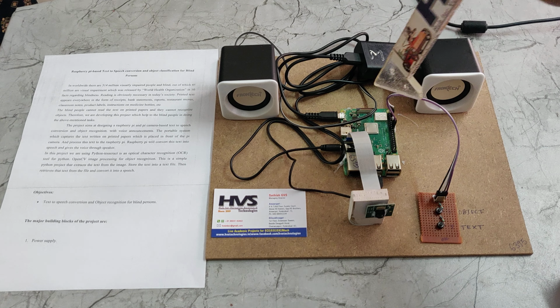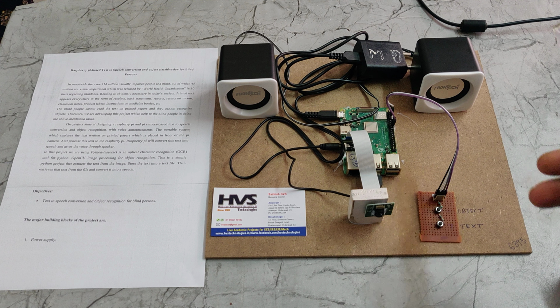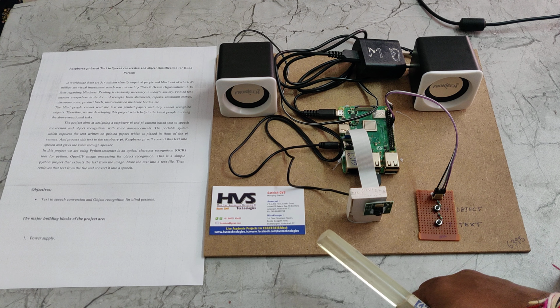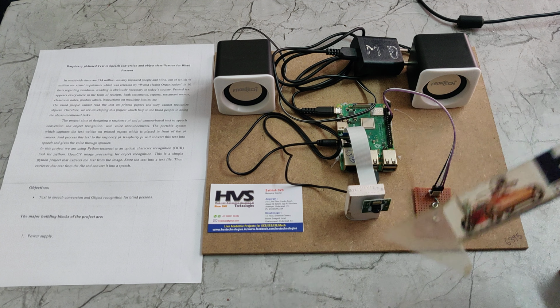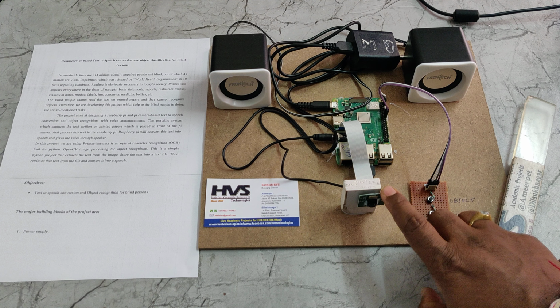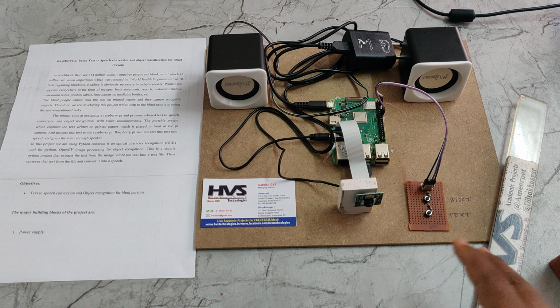Initially we need to load the operating system, the Raspbian OS, into the 32GB class 10 memory card. After loading the OS, we code the project requirements in Python, and for that code we need to install OpenCV and the eSpeak module for the voice announcements, and Tesseract OCR for optical character recognition. After installation, we code the system to first read from the selection switches, and then capture the image. For every image capture, we can see the light indication on the Pi camera here. Then, based on the selection, it will go with text extraction using Tesseract OCR, or object classification using OpenCV.